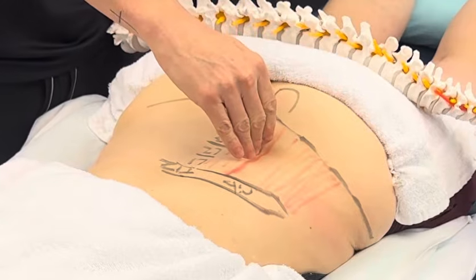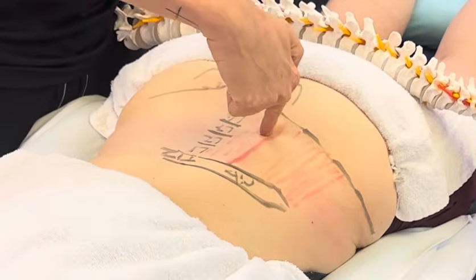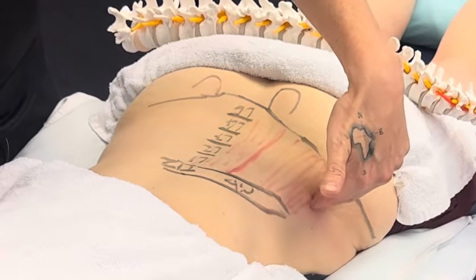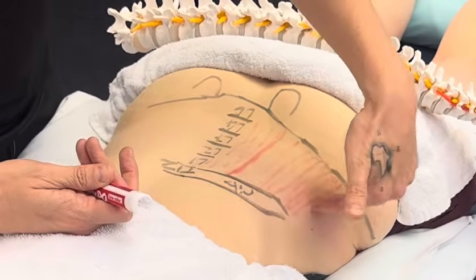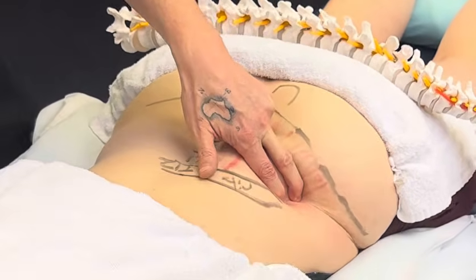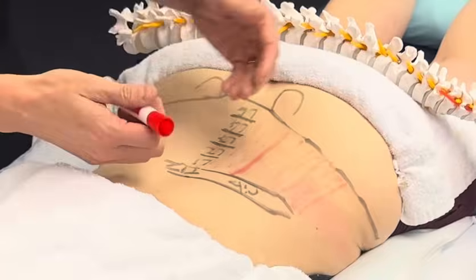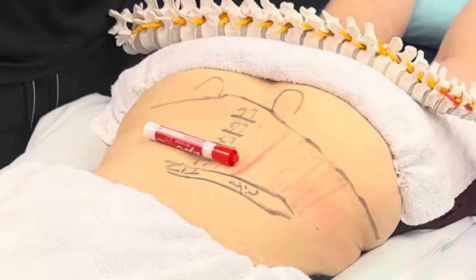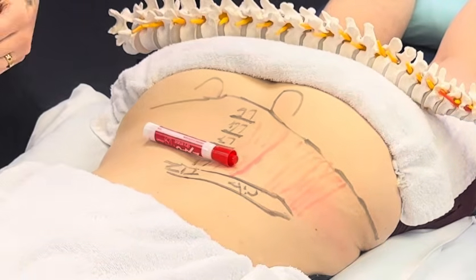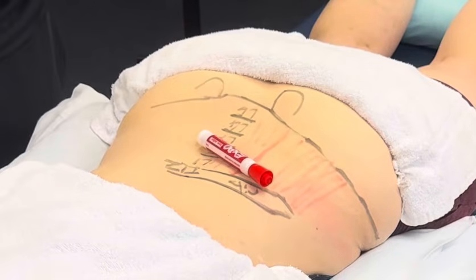Paraspinals, what's deep to the paraspinals? Multifidus, yeah. Usually for paraspinals, we needle full depth and include the multifidus. In the quadratus lumborum, in the QL, we're gonna bracket it like that and needle lateral to medial. It's just muscle, and here's the spinous process, here's the transverse process, right? So you've just got muscle, and then you've got the backdrop of all of that, okay? And you're gonna be surprised. This doesn't really do it justice.